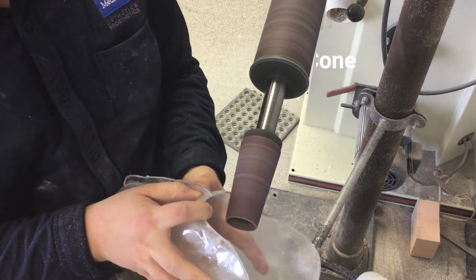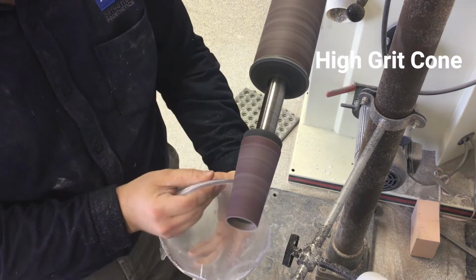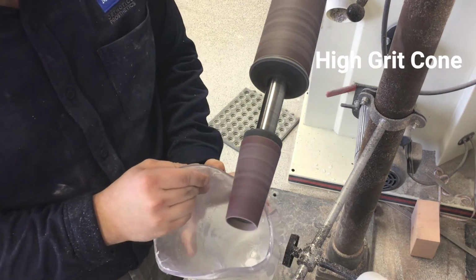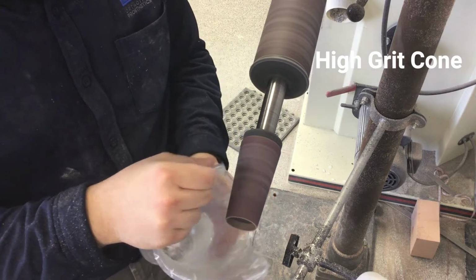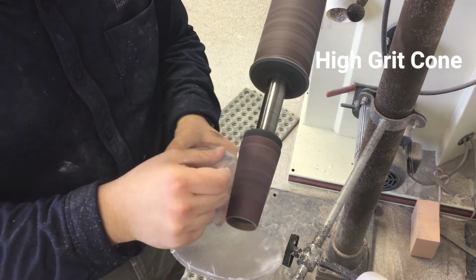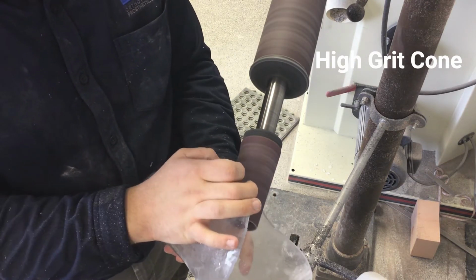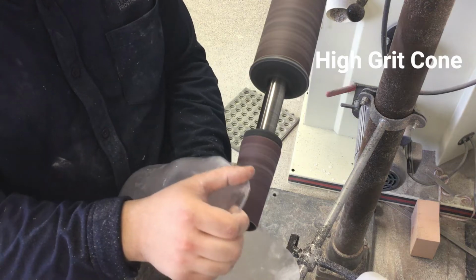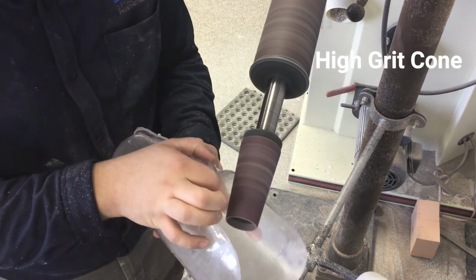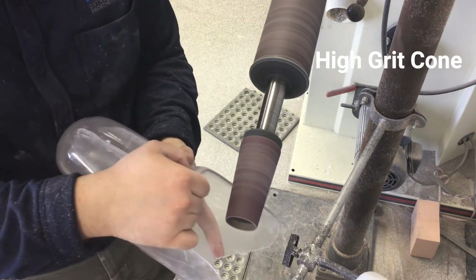First, we will use a higher grit cone to bring down the plastic to the appropriate trim lines and level out any rough edges. We should be using a long pulling motion to bring down the plastic with this cone. By the end of using this cone, the socket should be at the desired trim lines and have a 90-degree edge on the inside and outside of the socket.